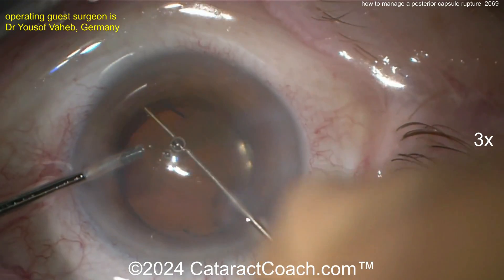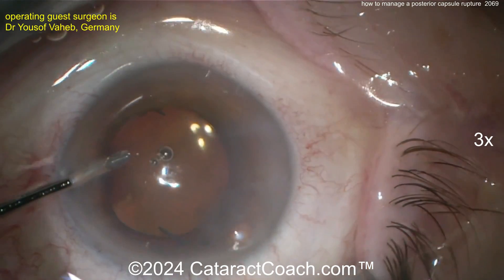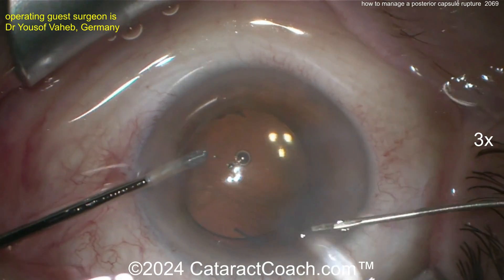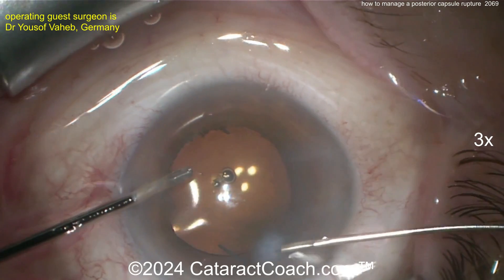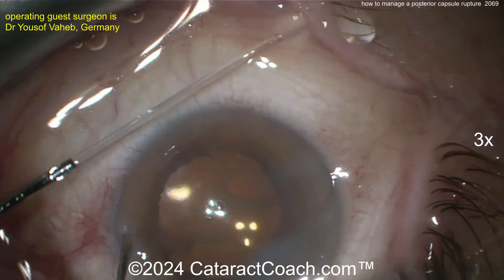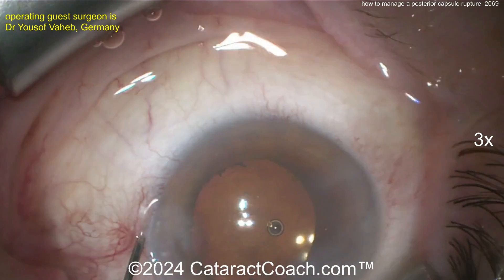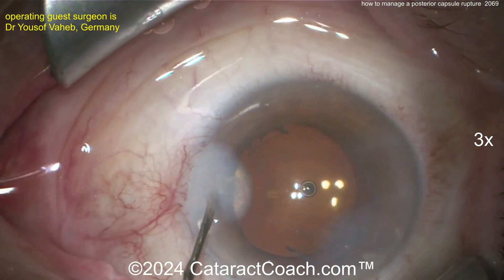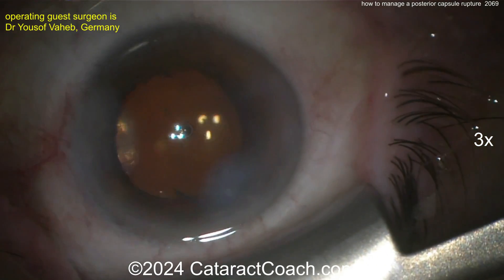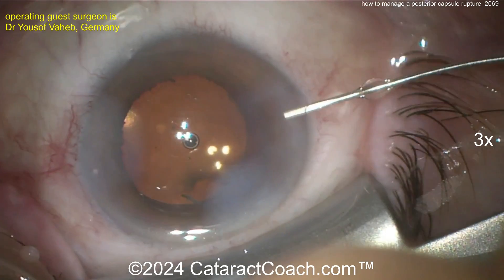Even then, remember your risk of endophthalmitis is higher in patients with anterior vitrectomy and posterior capsule rupture. Your incidence of retinal issues is higher, and CME is higher — so watch these patients more carefully in the post-op period. Notice the surgeon is now sealing up the second paracentesis. For the bimanual vitrectomy, a different incision was made — don't use the main incision. Good job; now those are sealed up.